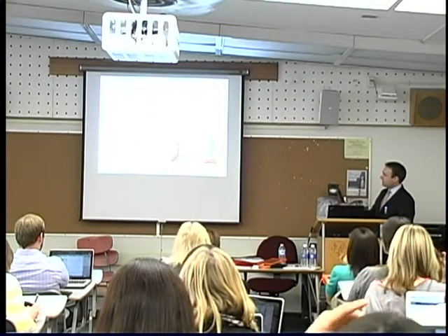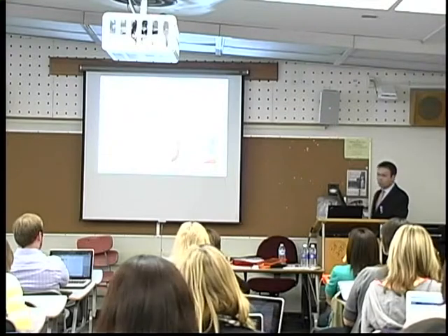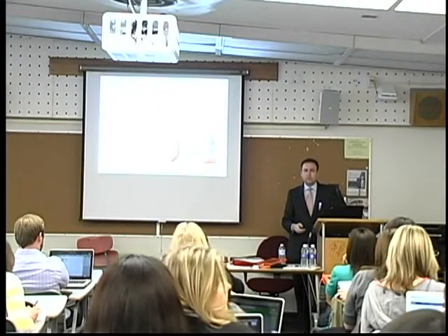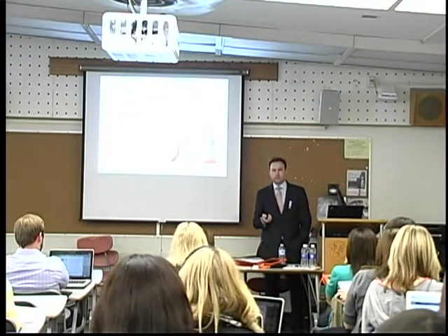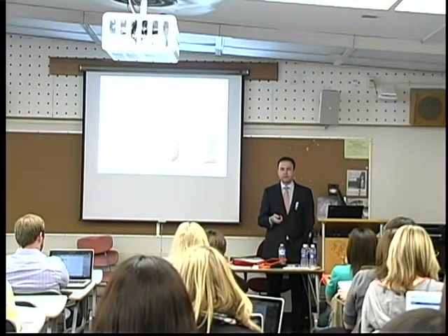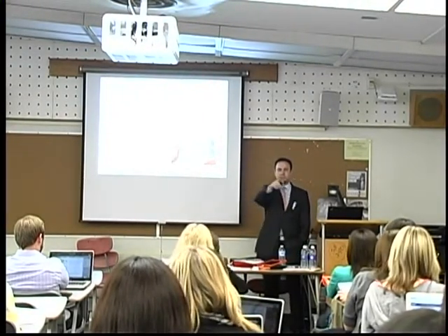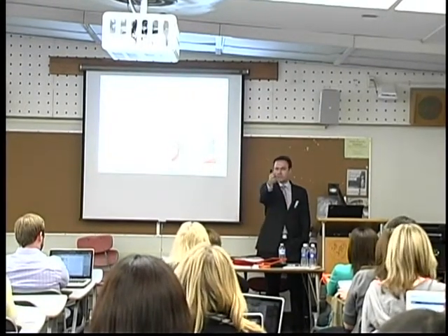Right. So that led us to design our own app, and this app is called SpeakAll. It was originally developed by Purdue engineering students. I just have a couple questions. The first: to get the ProxTalker and also an iPad with an app on it is very prohibitive for a school district to fund. What are your thoughts on going straight from PECS to an iPad app such as SpeakAll? That question was exactly the question that we asked for our follow-up research project, because people had said exactly the same thing.